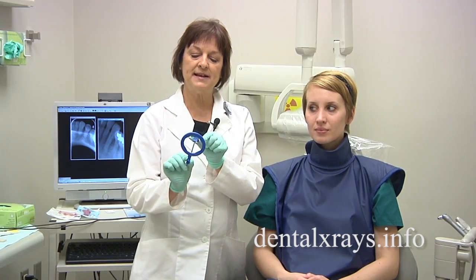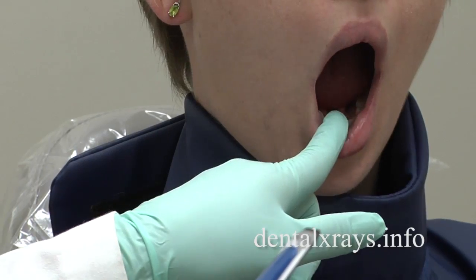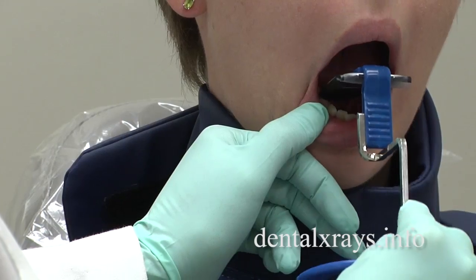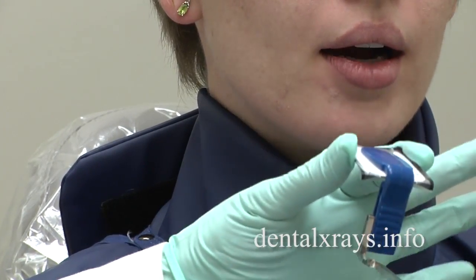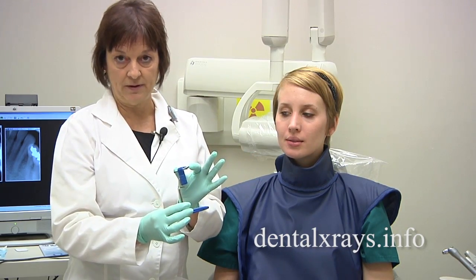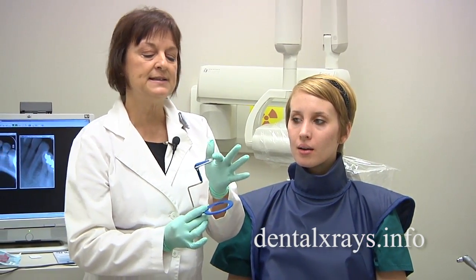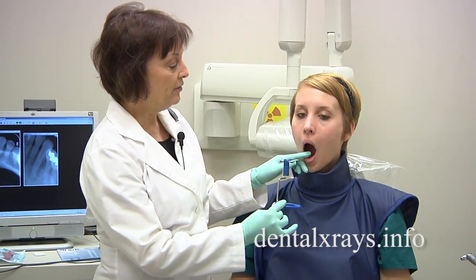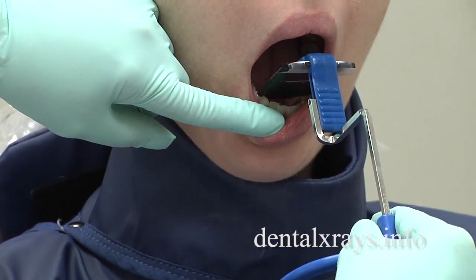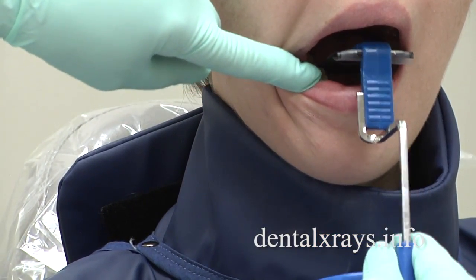The size 2 film is many times too large for a very narrow mouth. It doesn't fit from side to side behind those front teeth because it is way too wide. So there are two options: switch to a narrow size 1 film, or if your office doesn't have them, place the very edge of this film farther back into the mouth so that it fits between the dental arch. You can see I've got the film way back by the molars.